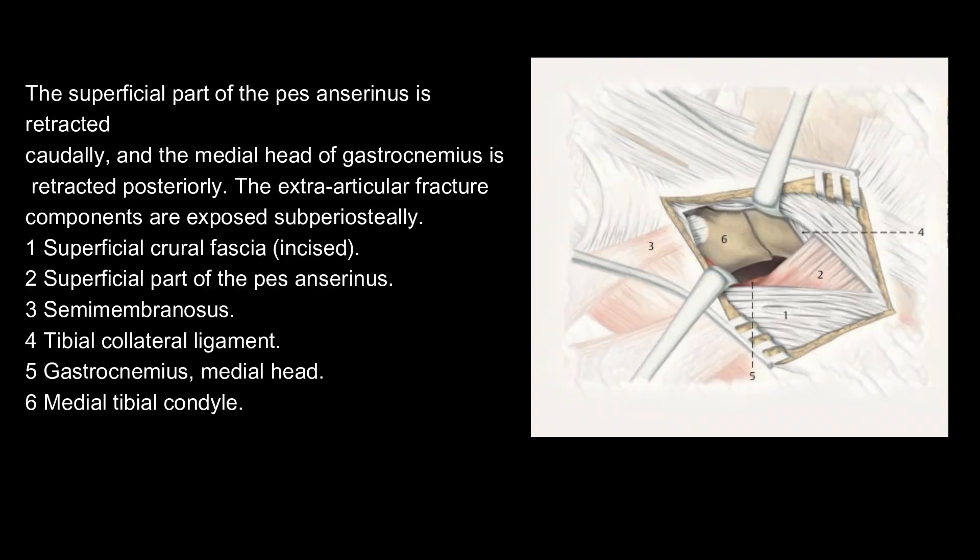The superficial part of the Pes anserinus is retracted caudally, and the medial head of gastrocnemius is retracted posteriorly. The extra-articular fracture components are exposed subperiosteally. Structures visible include: superficial crural fascia incised, superficial part of the Pes anserinus, semimembranosus, tibial collateral ligament, gastrocnemius medial head, and medial tibial condyle.